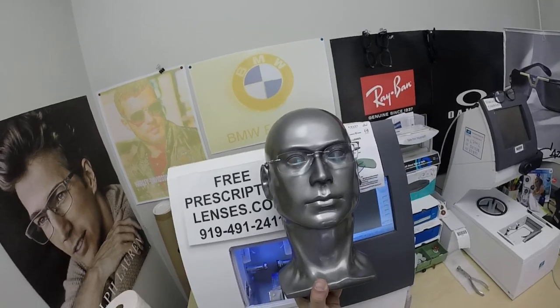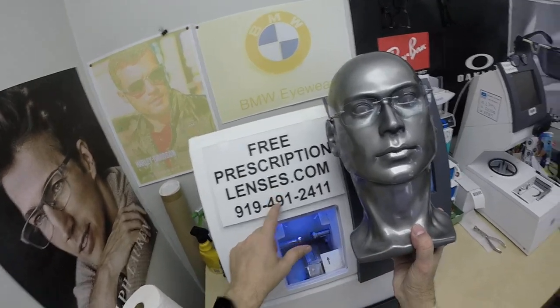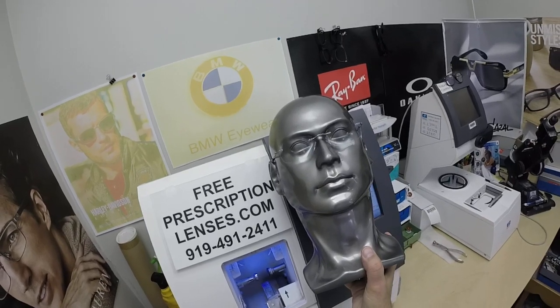The three parts — the bridge and the two temples — sell for $300 complete with one free pair of clear single vision prescription lenses. Any add-ons are available.